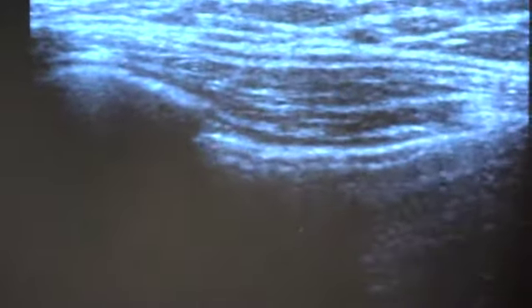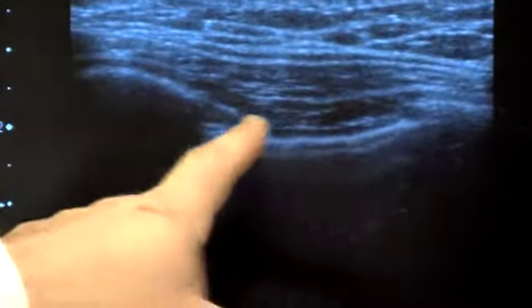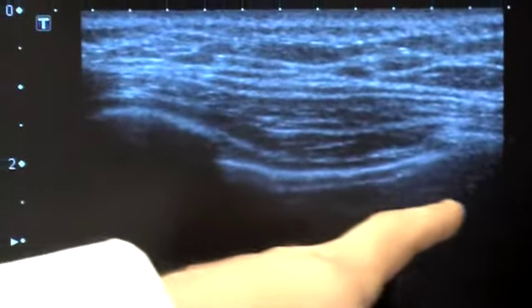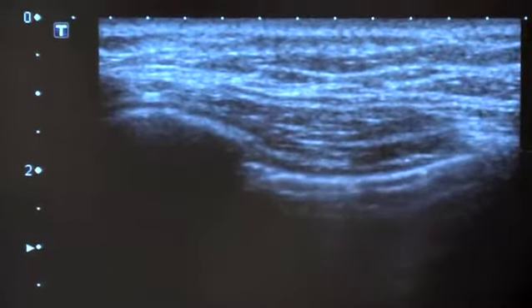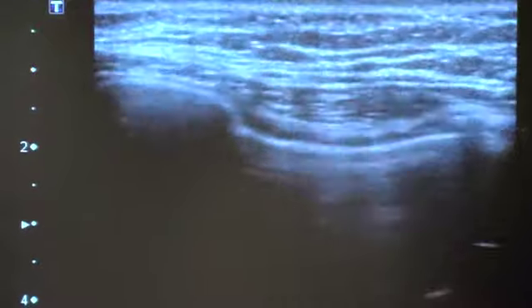You can see in here there's almost like ants marching up and down this brightly echogenic line. This lung is sliding back and forth, and sometimes you see these little reverberation artifacts or comet tail artifacts coming down from the pleural line. That means there is no pneumothorax there because those two pleural surfaces are basically sliding against each other.